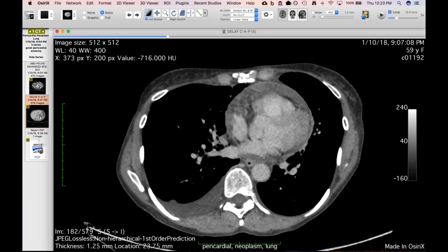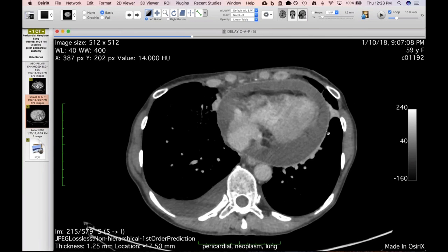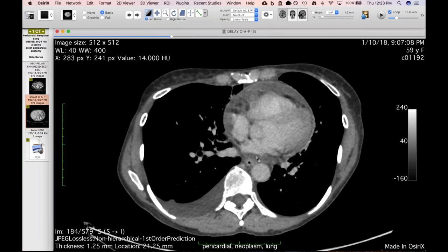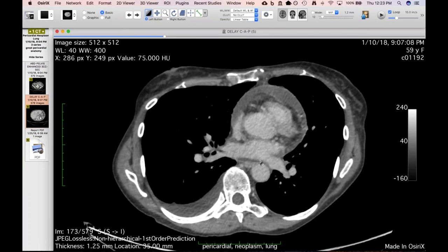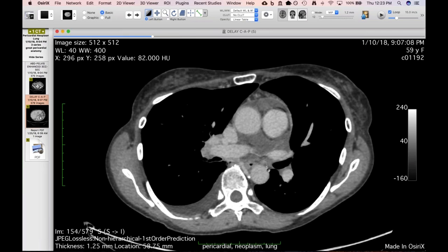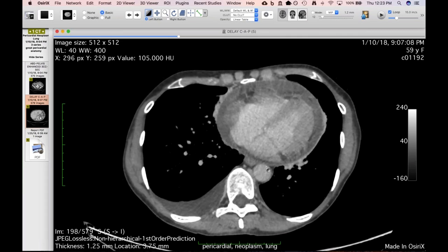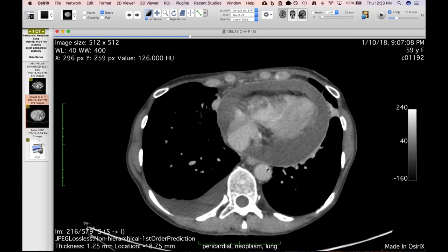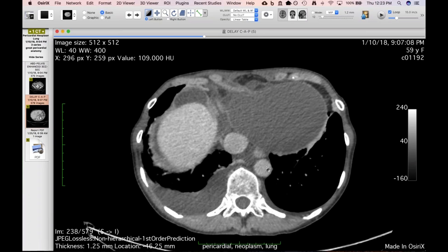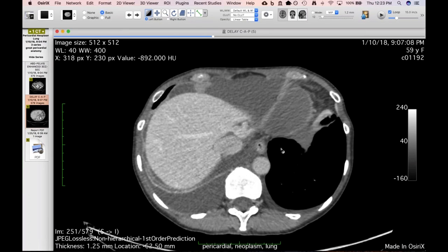You can see smooth, circumferential pericardial thickening and enhancement, totally encasing the heart. It's a nice example of the oblique sinus; the transverse sinus is also outlined. She had a little dyspnea but no pain. Given the history of diarrhea, we were thinking probably some sort of viral pericarditis. She also had a little bit of ascites.